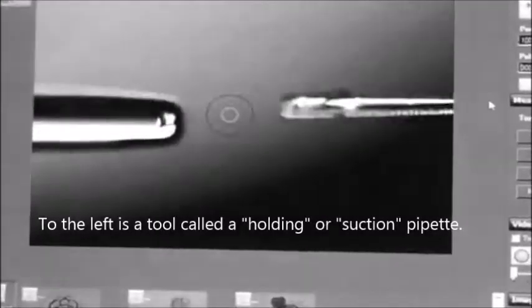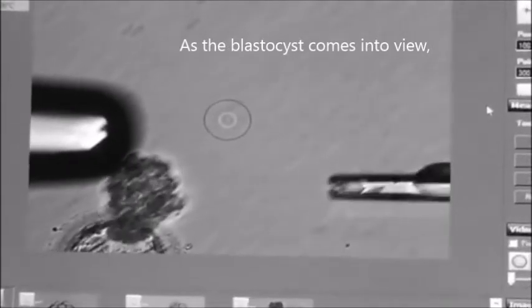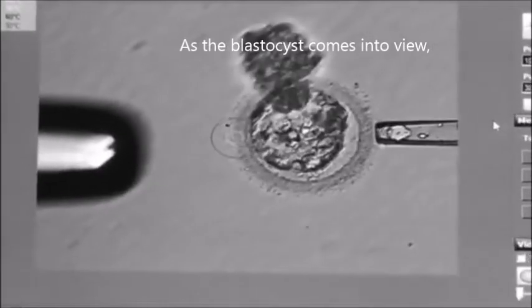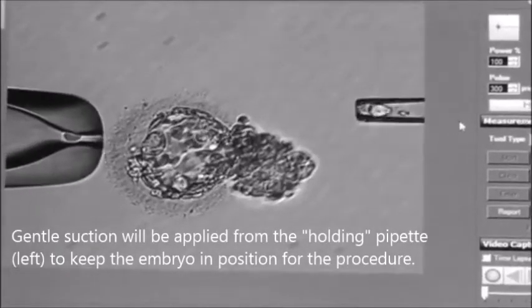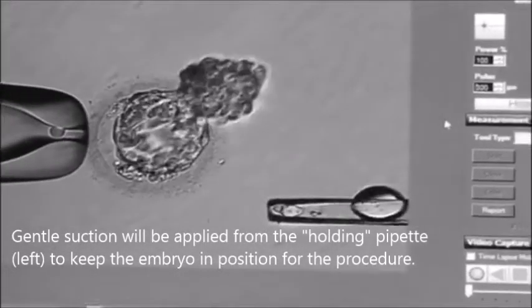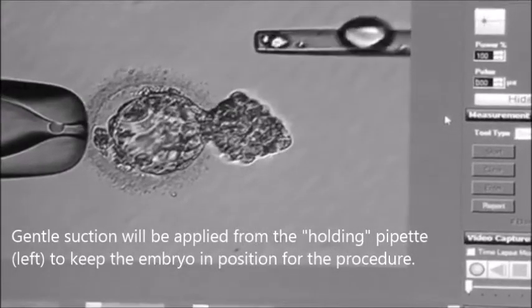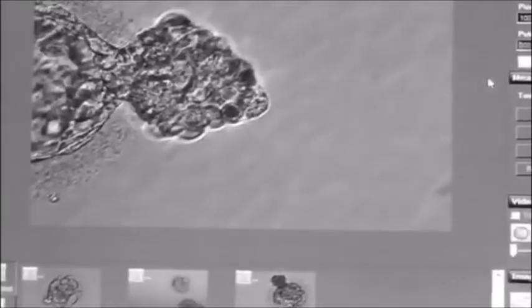He's going to pull and remove tissue from the trophectoderm, which forms the placenta later on in development. He puts suction on the holding pipette to the left. That part of the embryo is starting to hatch out — this part is the inner cell mass — and he's going to take cells from the trophectoderm portion.